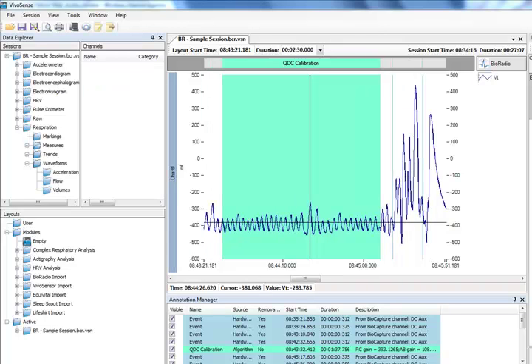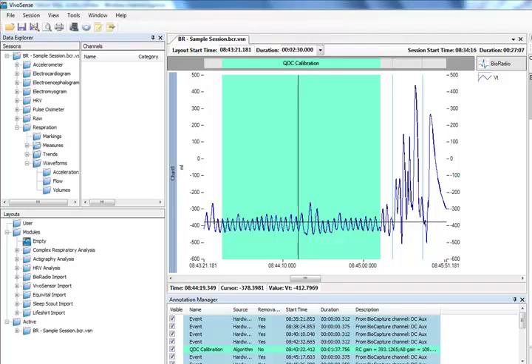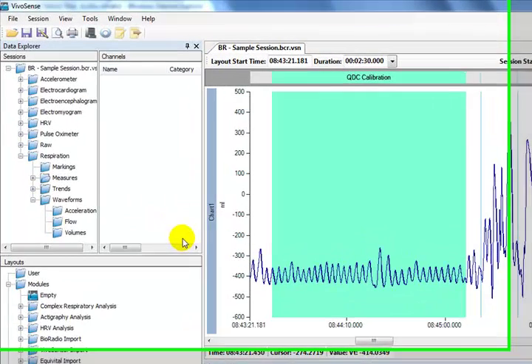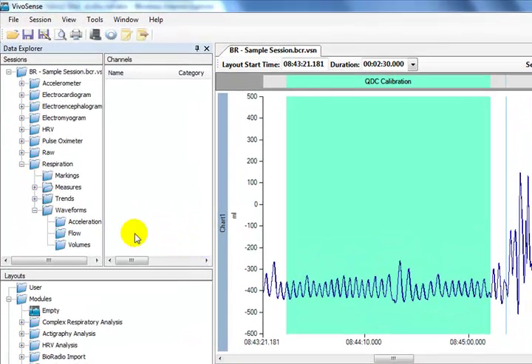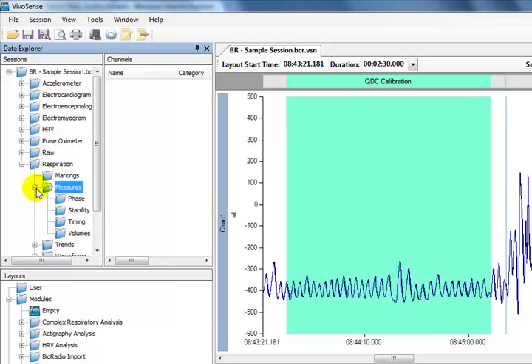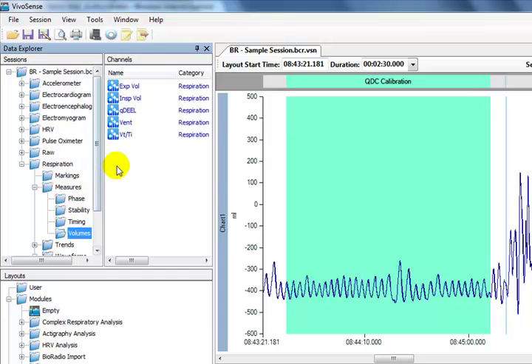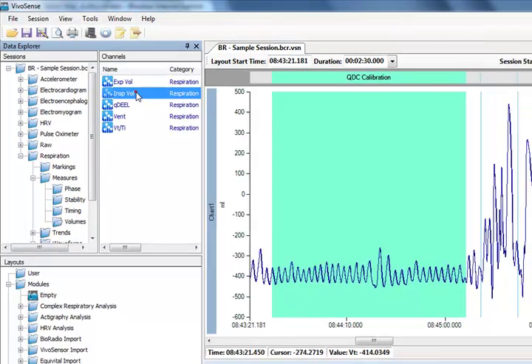Once we have completed a QDC calibration, we can do a fixed volume calibration. We need to add the inspiratory volume channel to the Synchronized Chart panel to do this. The fixed volume calibration can only be done on this channel. Let's add the inspiratory volume channel now.